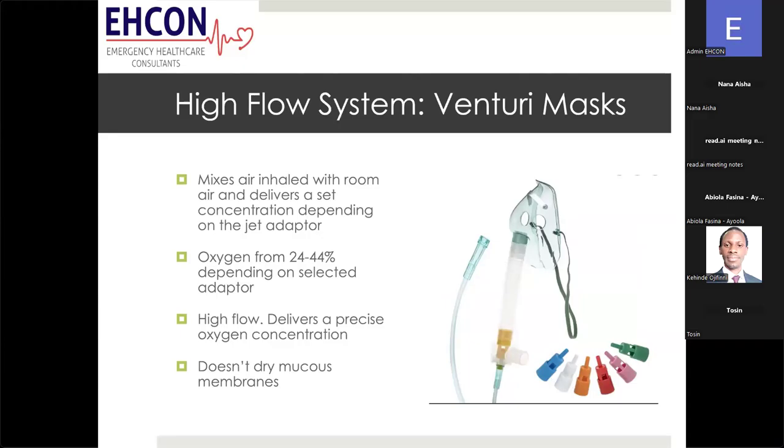You can deliver from 24 to 44%. And it doesn't matter how the patient's respiratory dynamics or physiology is going. Once you select the jet adapter, the Venturi mask is delivering that oxygen to the patient at that rate each breath. It's a very precise delivery system. It doesn't dry the mucous membranes, which is a very nice advantage, but it has the same downsides as other masks, meaning it can be uncomfortable, patients can't eat, they really can't talk, and if they're vomiting, it may not be the best option.